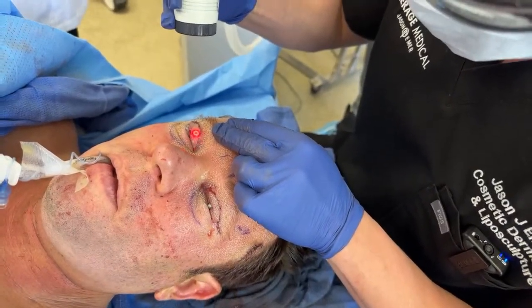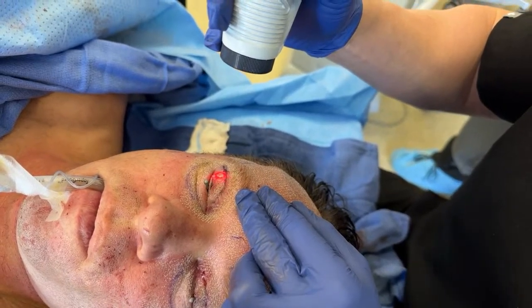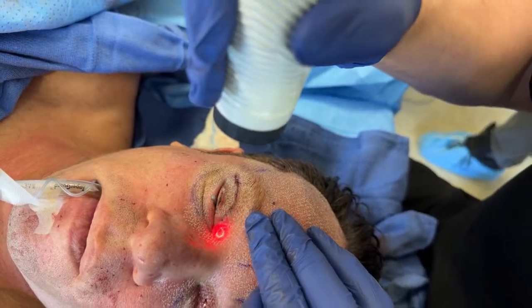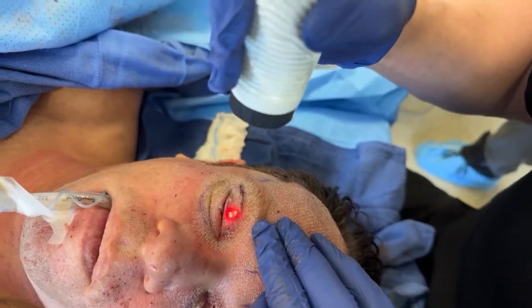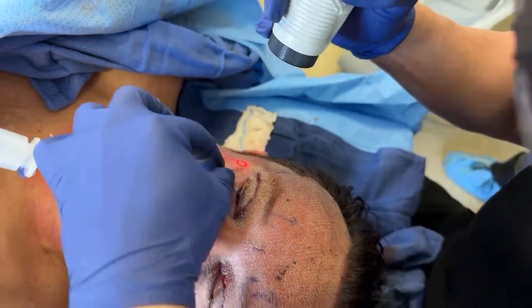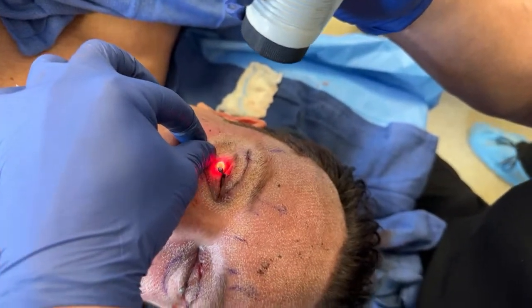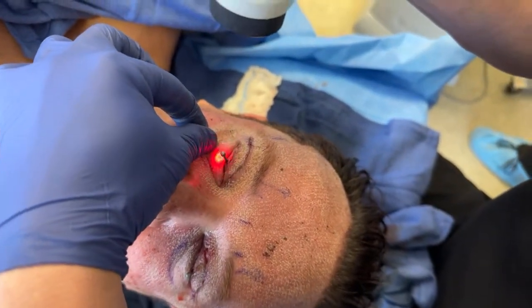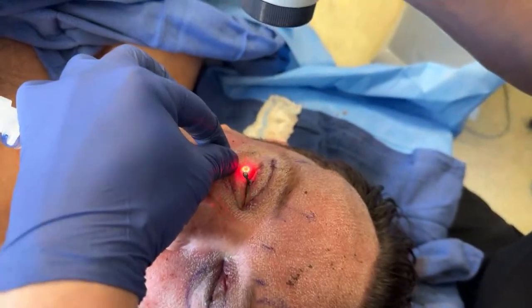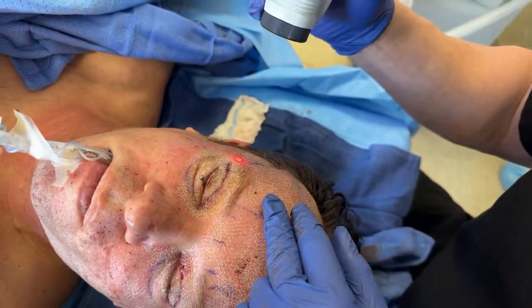And a common issue is blepharitis when you don't do the laser properly. You hit the edge or you don't do the proper skincare. So it's really important. Is this the CO2? Yes, it's the CO2. What setting is the laser on? You guys know we're not going to tell you that. And even if I were to tell you, the way I'm doing it is unique. There's a specific overlap here and a specific number of passes. You wouldn't even be able to replicate.